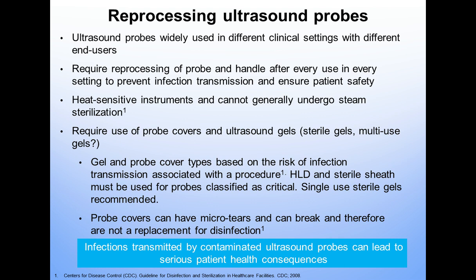The probe covers, I'm sure a lot of you are aware, can have micro tears, so it's really important to ensure that your disinfection is performed according to the Spalding classification. And sometimes some physicians think that probe covers can help you to be able to do more procedures. You don't have to do the reprocessing, but that is false. And so, as all of you know, even though you use a probe cover, you still have to follow all of the procedures for reprocessing.